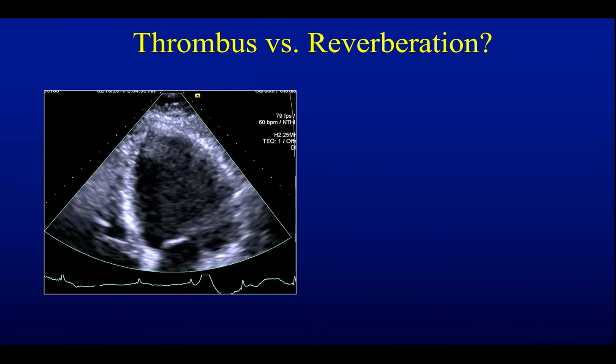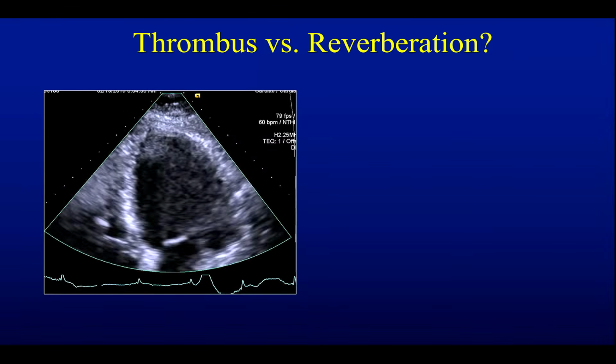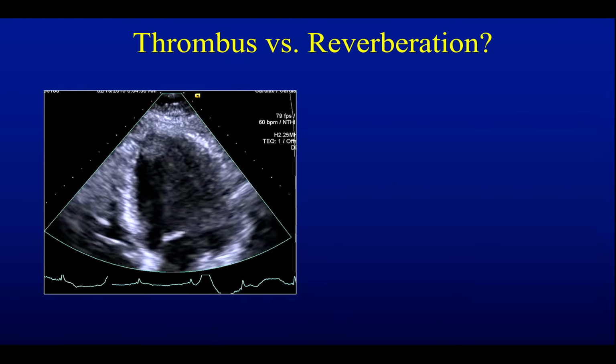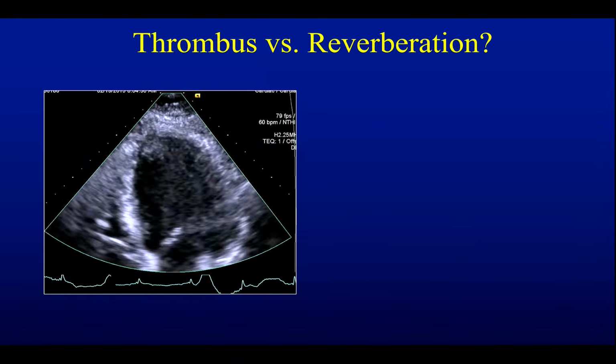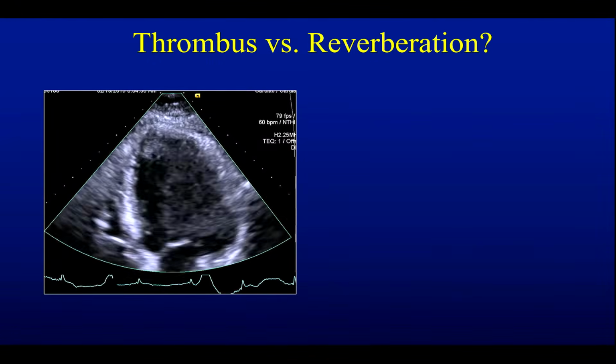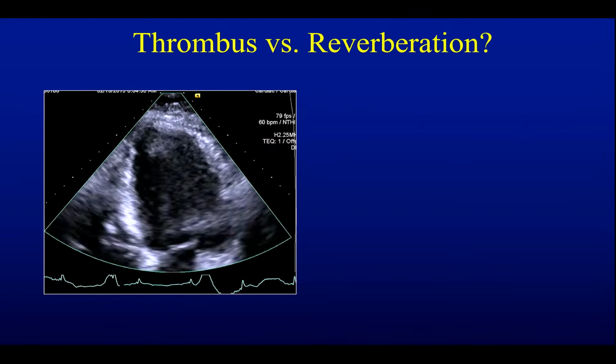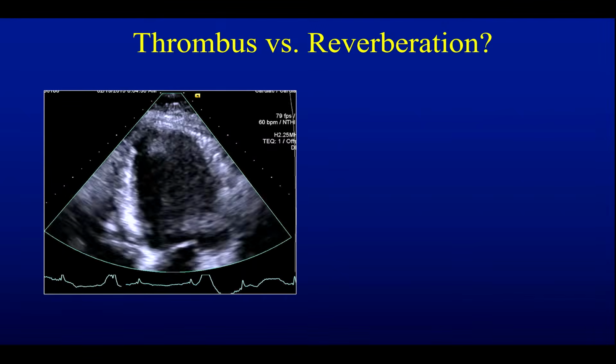Usually, if you don't have contrast, if you're stranded on an island without contrast, or you don't have an IV, right? What do you do usually? You change the angulation. You go maybe a short axis towards the apex, or change the window. So hopefully you try to decrease this. All right. What's the vote?